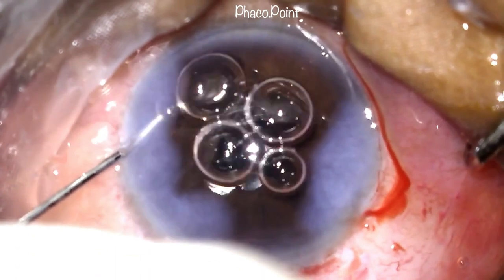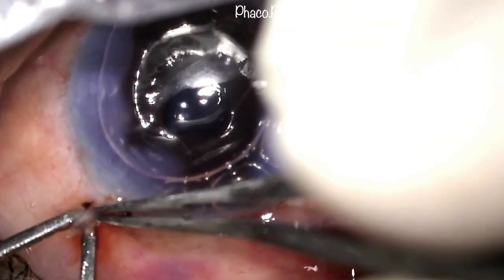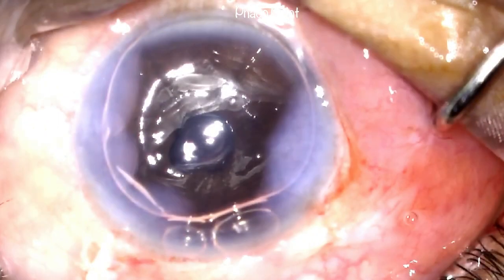Following the completion of the stromal hydration, we introduce some air into the anterior chamber. The wound is secured by performing a bipolar cautery. And finally, this is the end result that we have achieved.